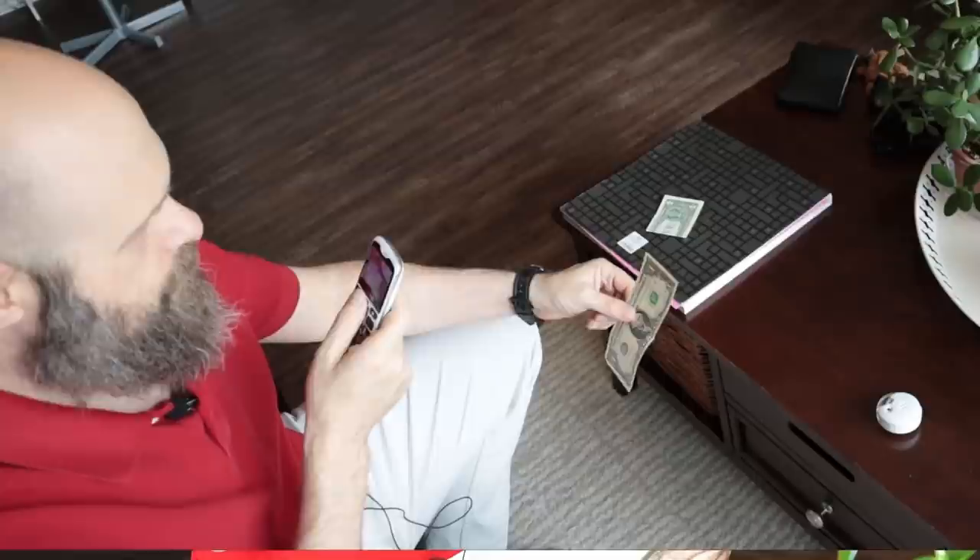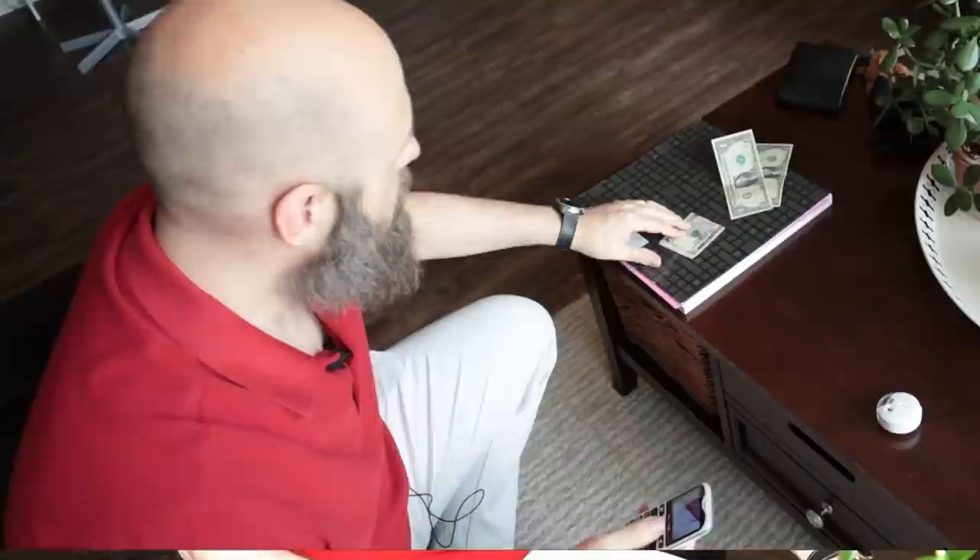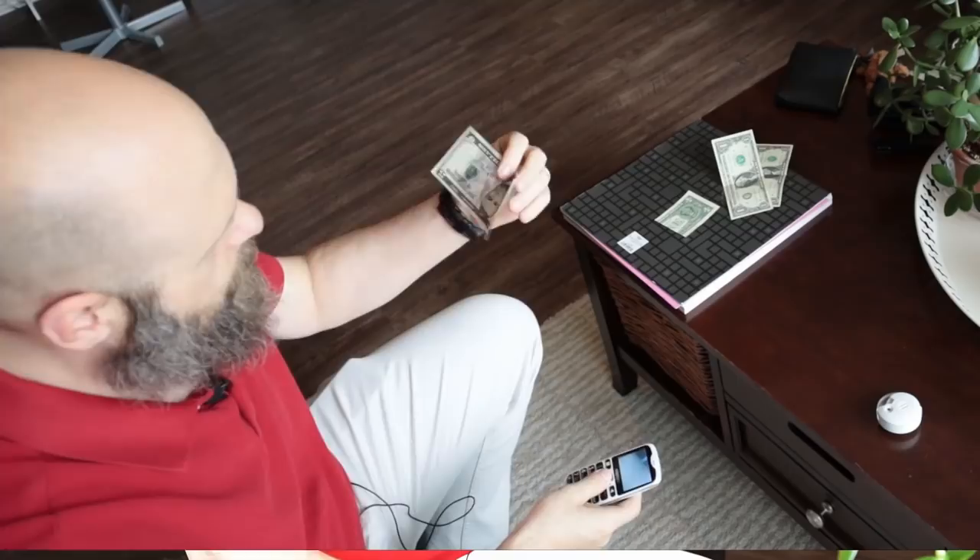Now let's try the banknote recognizer. I click OK and the camera activates with clicking sounds. Pointing the camera at a random US banknote, it says 'One dollar' — confirmed correctly. Trying again, one dollar again. Then pulling out another bill, it says 'Five dollars' — had to move it around a little bit for that one, but it got it.